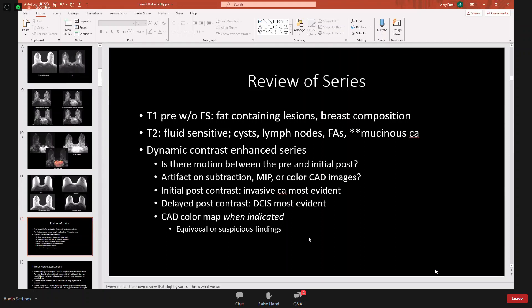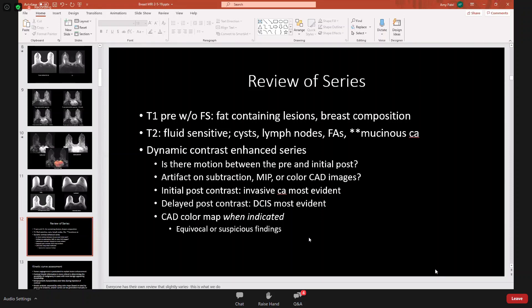The initial post-contrast series is when invasive cancer is most evident, while DCIS is most evident on delayed post-contrast imaging. The CAD color map is used when indicated, though most breast imagers don't rely solely on kinetics — morphology trumps kinetics is a guiding principle. A kinetic curve assessment helps determine whether something with more benign-appearing morphology might actually be malignant.